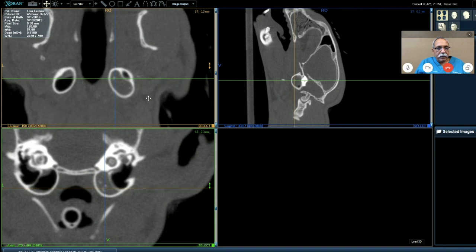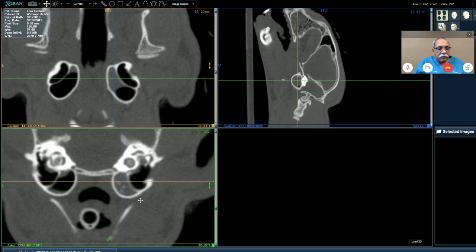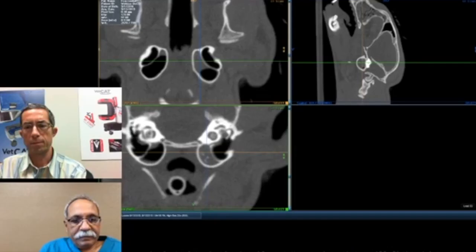So that's basically what the CT is right now, as a very basic introduction. But if you get more into that, you will find, and it's amazing, once you start seeing things, you wonder what you were missing. It's very, very mind-boggling. Very, very interesting, Dr. Kureshi.